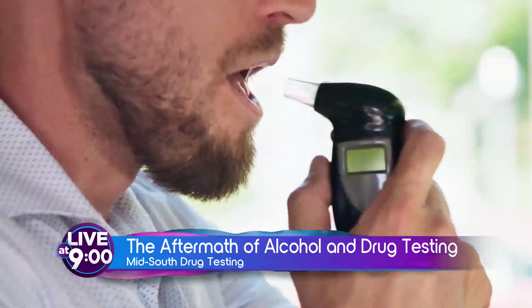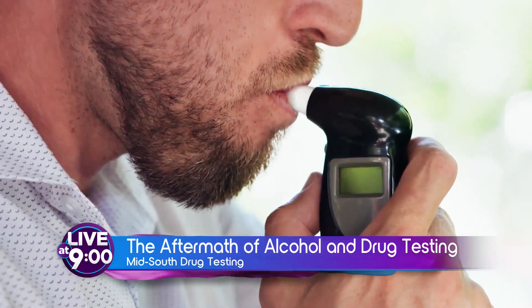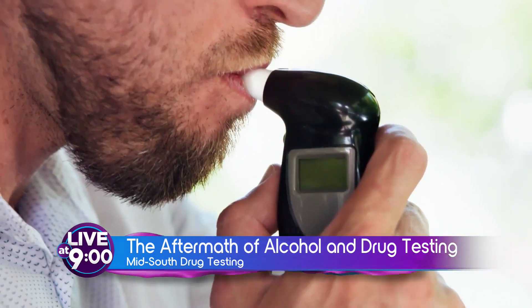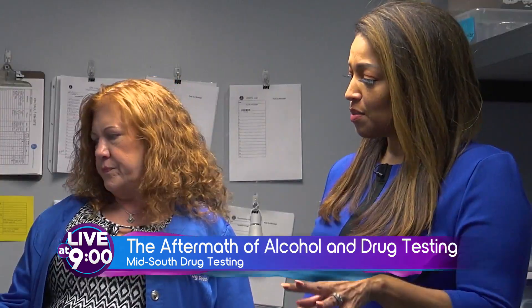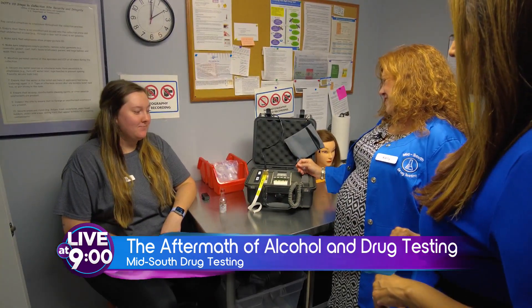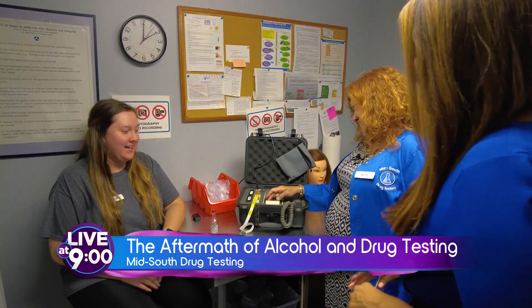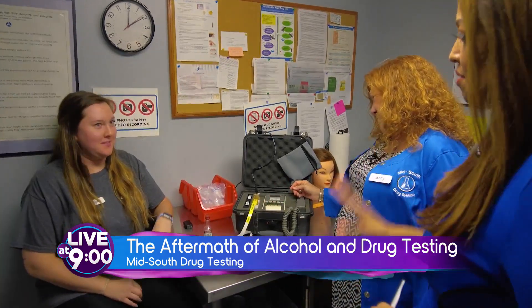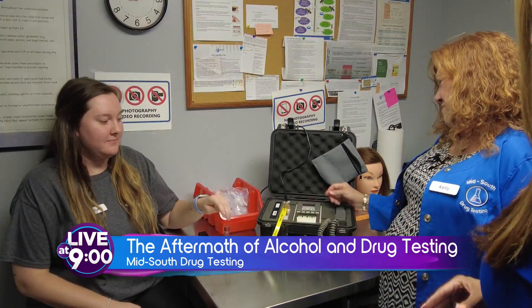So you do a lot of work with law enforcement, and we never really see what happens after a breath alcohol test leaves a squad car. So we're getting somebody drunk — we have our trusty subject here, who happens to be your daughter Madison. We also have a small bottle of vodka, and so you're just prepping the machine here?